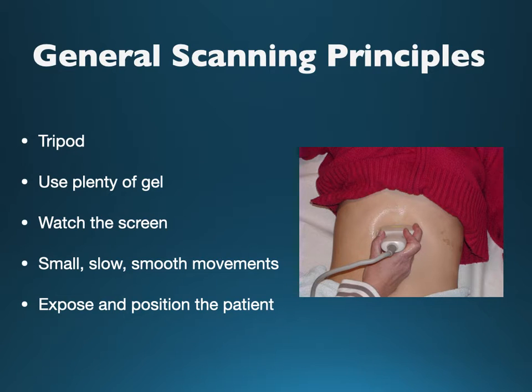Generally, for liver parenchymal evaluation, we will have our patient supine, but often turning our patient to the left lateral decubitus position is helpful when evaluating the gallbladder, as it allows gravity to help flop the gallbladder close to the abdominal wall and out from underneath the liver. The gallbladder is best seen with at least 4 to 5 hours of fasting and is usually seen at the inferior aspect of the right liver lobe.